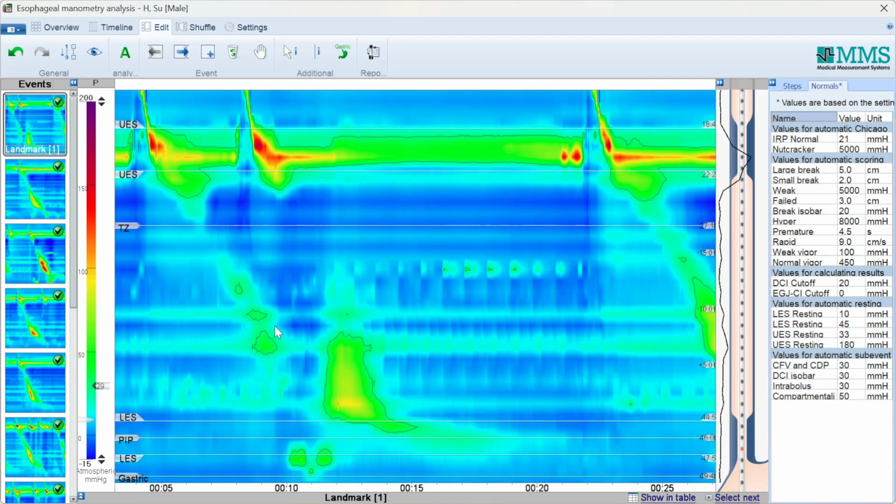What it means, for example: let's say we started giving the patient the swallows, and at swallow number 5 he can't tolerate it. He says, okay, I have to stop. That means this procedure is useless. We can't rely on it at all.